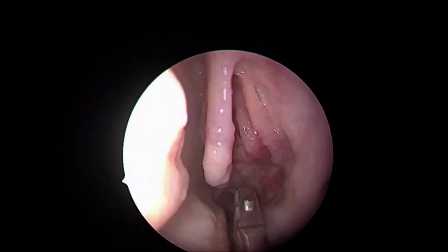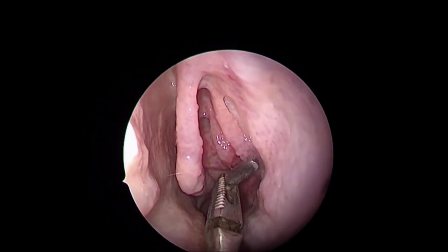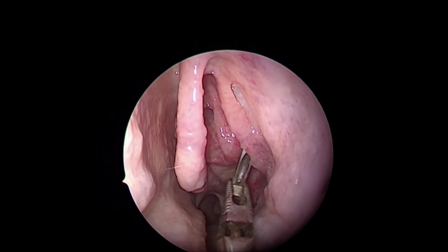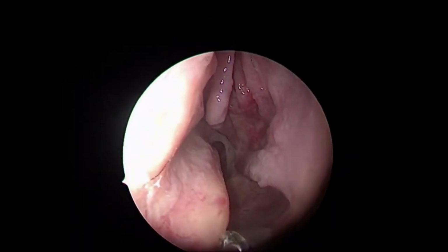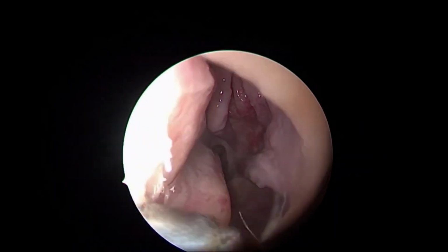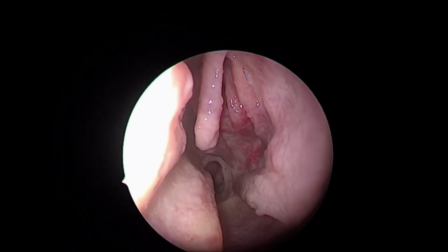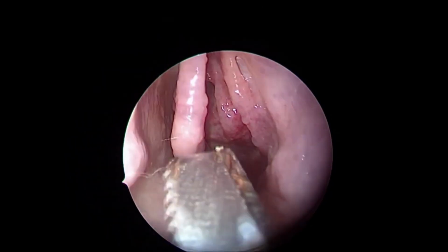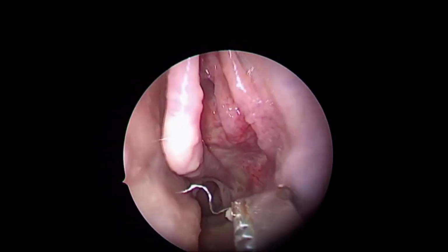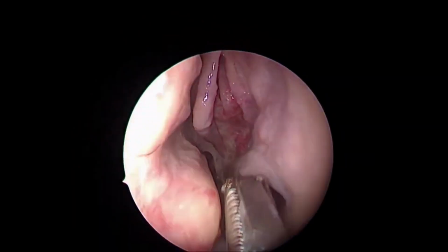So what we propagate, like we discussed last time when Professor Sethi was there, is the reverse biting. See this reverse biting? One word for the instrumentation for the junior colleagues. See this, I am in the left side of the nose. Take the advantage of this columella to park your endoscope, to take the help of the endoscope stability, and then introduce your instrument along the lateral nasal wall. Whenever you go in, your instrument along with telescope should go in. Whenever you come out, they should come out together.